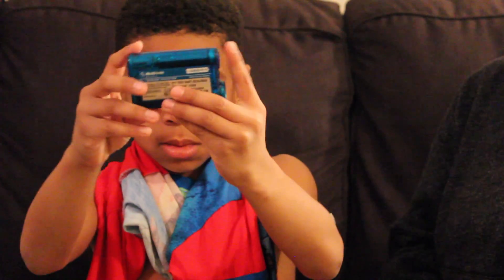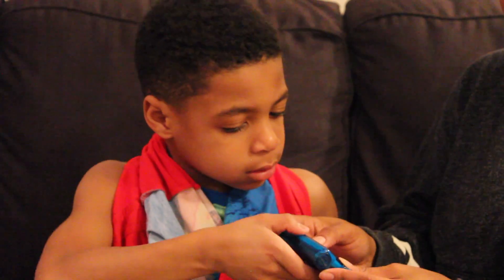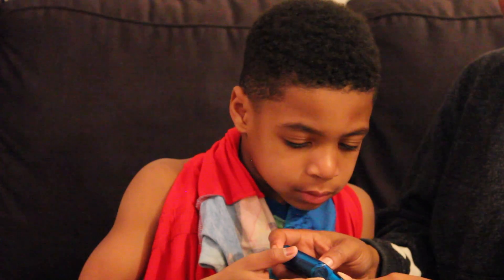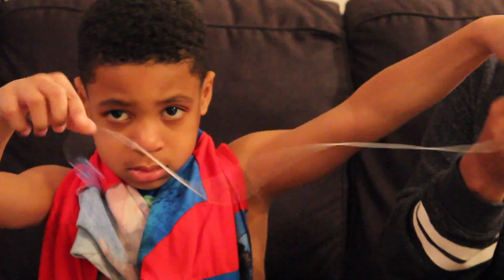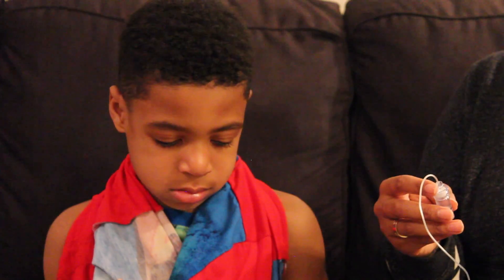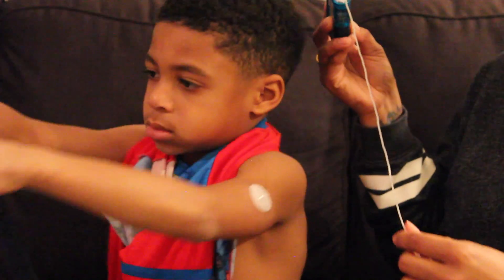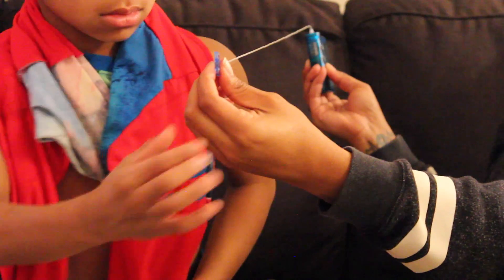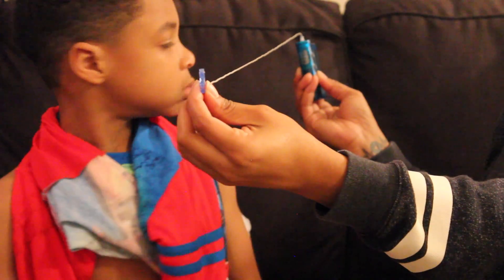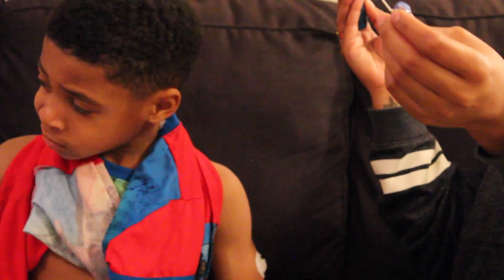Here is the insulin pump — this is the device that works with the infusion set and gives Landon his insulin. I go through the necessary prompts, which allow me to fill the tubing up with insulin. Now I am putting the reservoir into the reservoir compartment of the insulin pump. I am now purging the line, meaning I'm getting out any air bubbles that might be caught in the reservoir and pushing all unwanted air bubbles out.